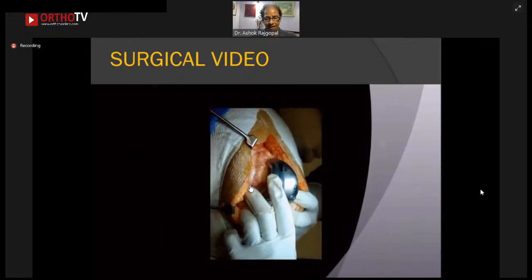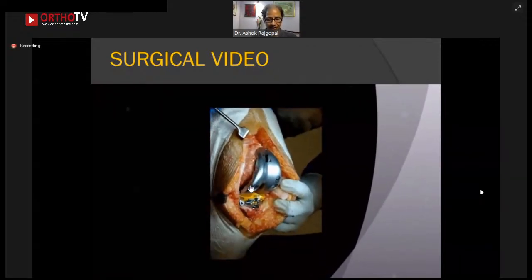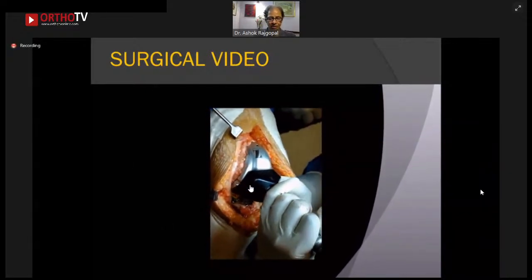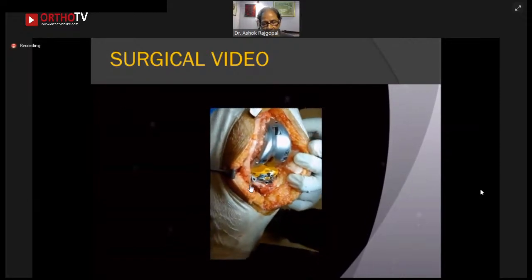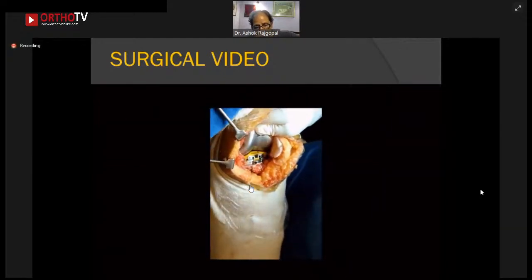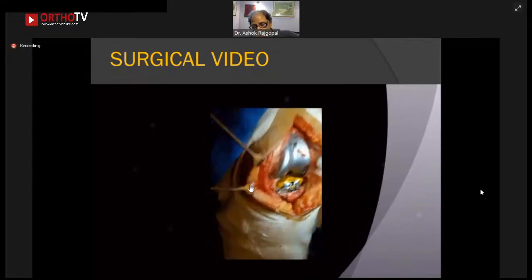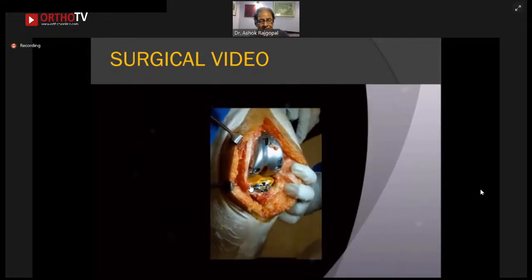We put in our trials. And rather than putting blocks and laminar spreaders, because you already have a released situation, you can pretty much jack it up and crank it up a long way. So we use our trials. We start with the base size of 10 millimeters. We check our range through 30, 60, 90, 120, and check our patellar tracking.